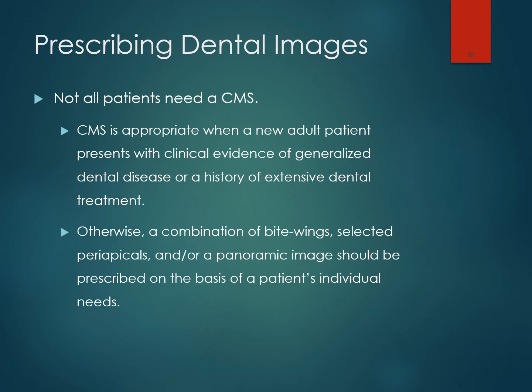Otherwise, a combination of bite wings, selected periapicals, and/or a panoramic image should be prescribed on the basis of a patient's individual needs. This happened to me a lot in private practice where my patient would come in, they wouldn't have a very extensive history of dental disease, and they would be new to me. And so I would go to my dentist and I would say, they don't have any problems. I took a peek around in there. They don't have a lot of fillings. They don't have any issues. They're young, they're healthy.